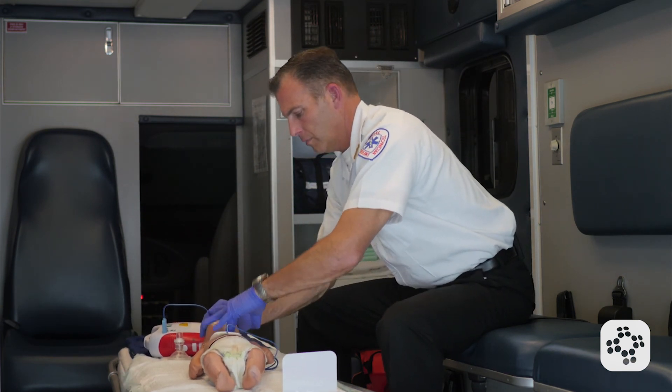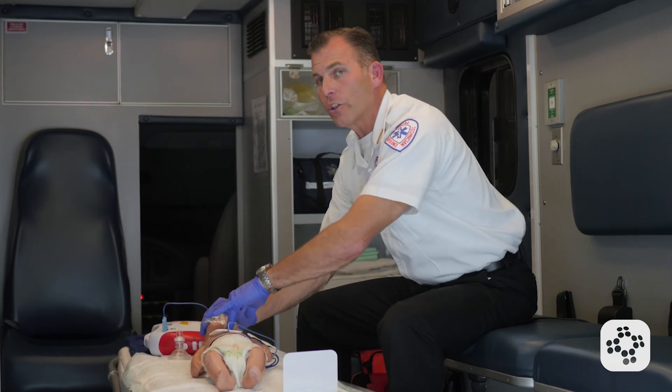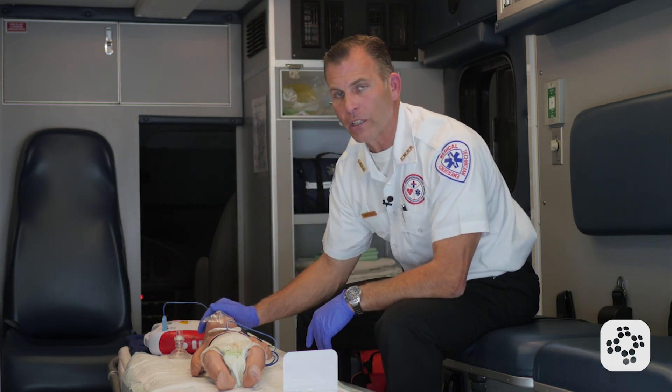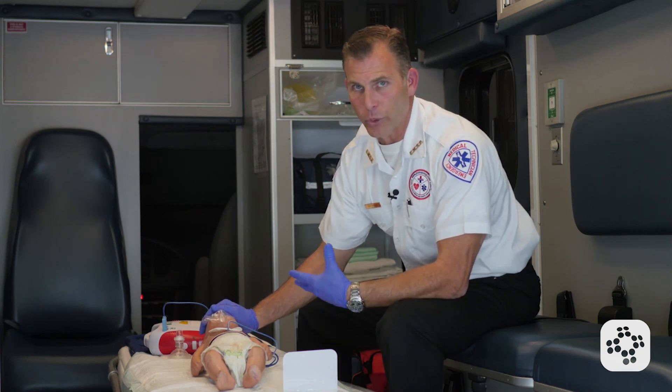Begin five cycles of CPR. I go right back into my CPR compressions and continue to do this until EMS arrives, the rest of the help comes, and we find definitive treatment for this infant — or until the baby starts to respond and breathe normally.